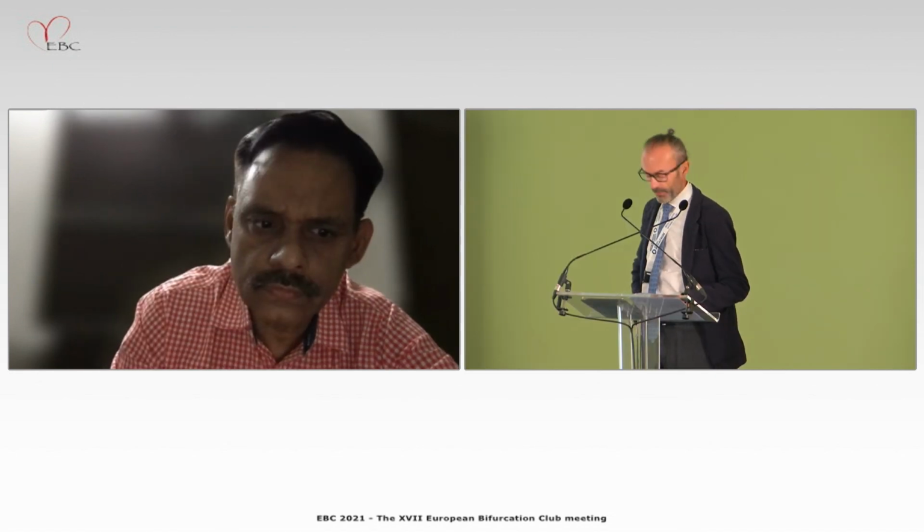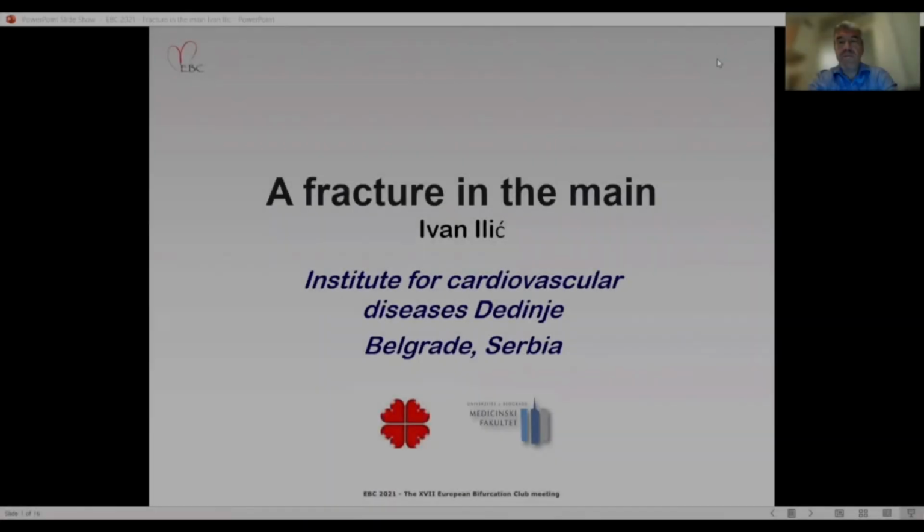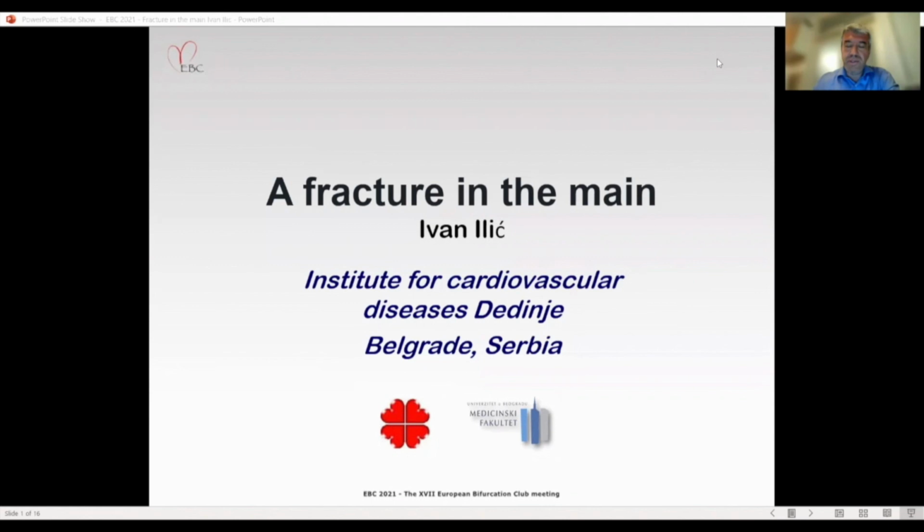Ivan Ilic will present this case. The title is Fractured Stent in Left Main. Dear Chairman, thank you for the invitation to present at the EBC 2021 meeting. The title of my presentation is A Fracture in the Main.